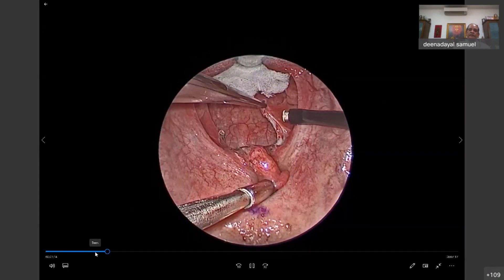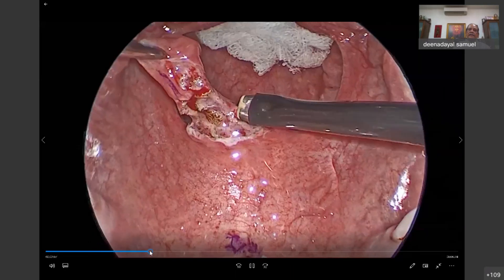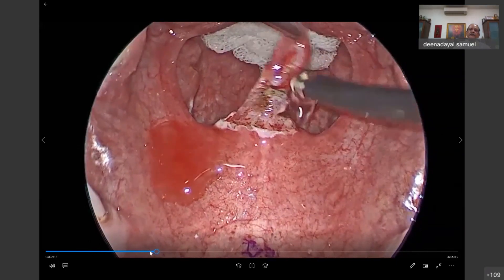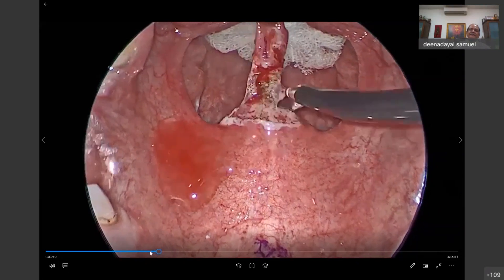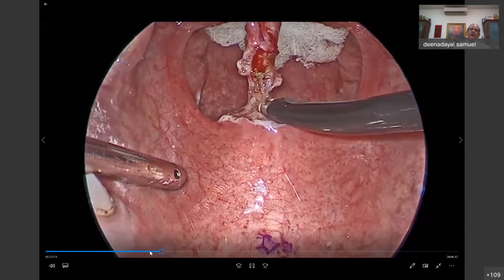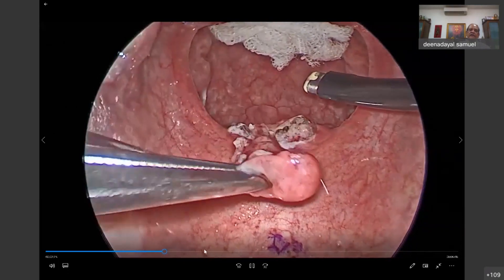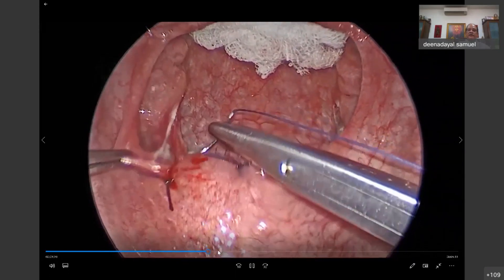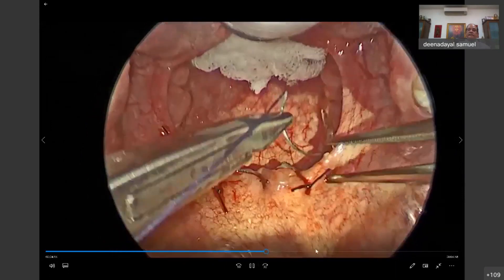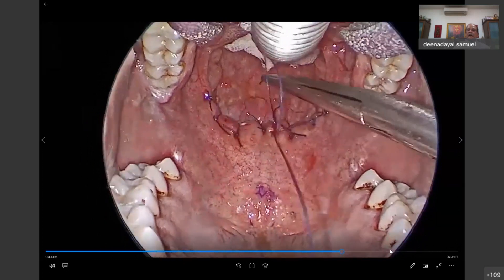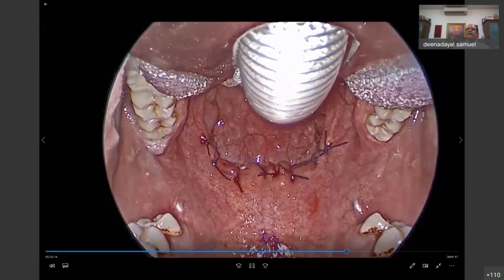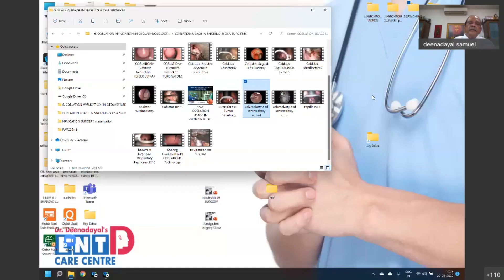The wand used here is a Reflex Ultra — a thin, small wand that dissects very well. No tonsillectomy was done in this case. Channeling was also done. This is a palatopharyngoplasty.